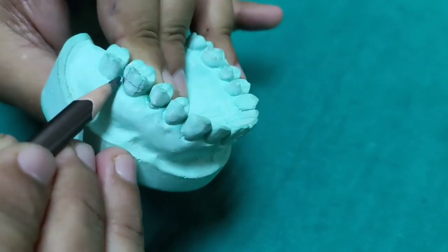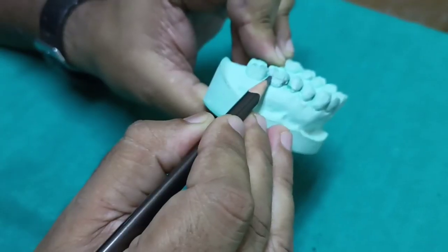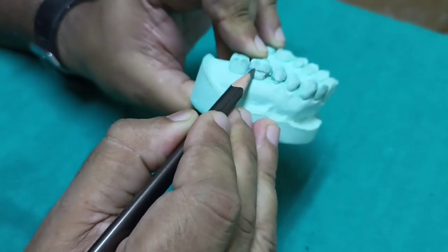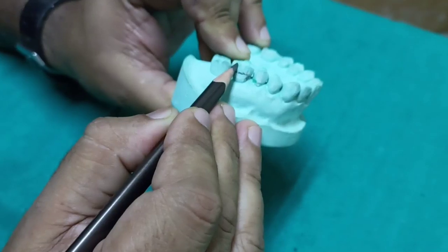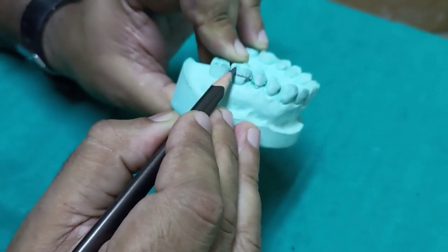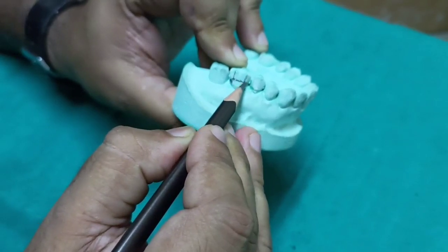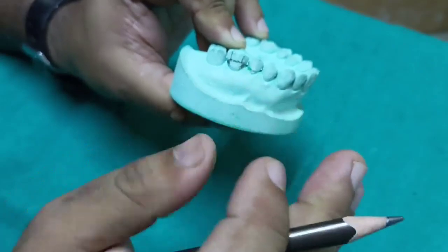The arrowheads of the clasp should engage these undercuts for getting adequate retention. The next step is bridge length determination. The bridge length can be decided by either of two criteria. The first one is the intercuspal distance. The second one is two-thirds of the total mesiodistal width of the clinical crown.